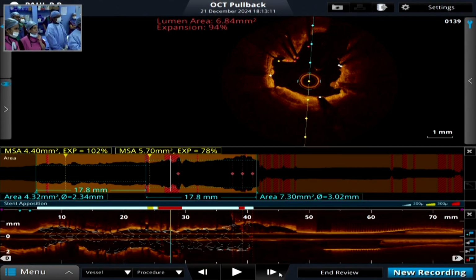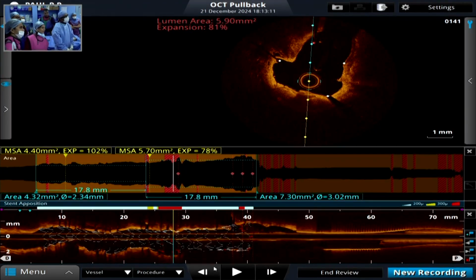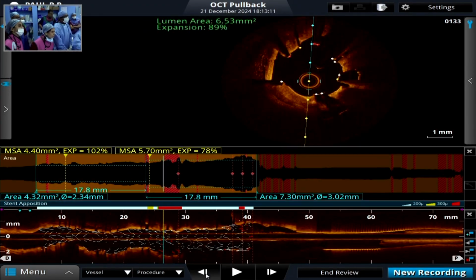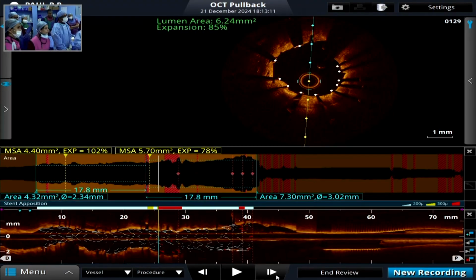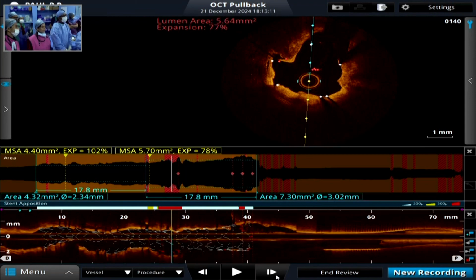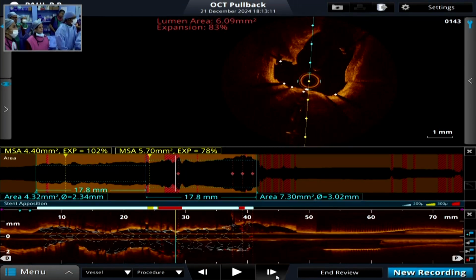Looks okay. That proximal lesion, at least it's opened up. The lumen looks okay. Distally, there is no dissection. Last shot in the cranial. LAD is flowing at the end of the day. Good decision that we went to wire the diagonal rather than having the wire in the distal LAD. Oh, we've already taken a cranial. Okay, I think we'll stop.